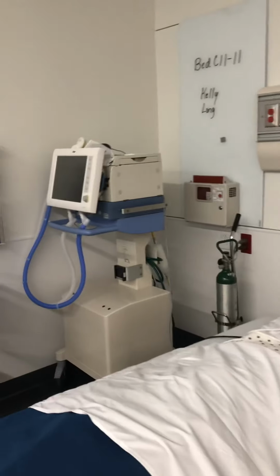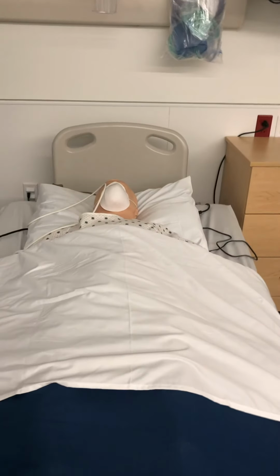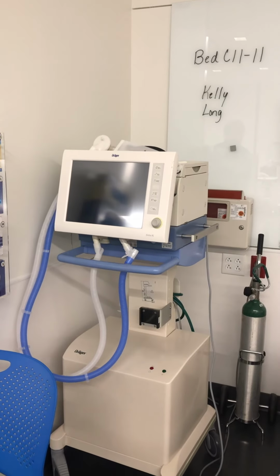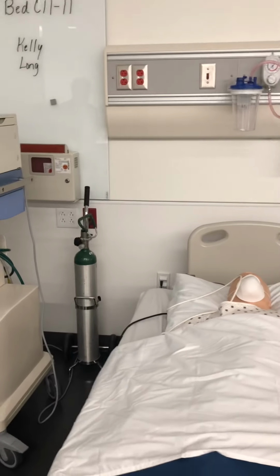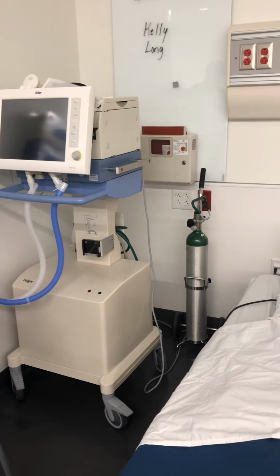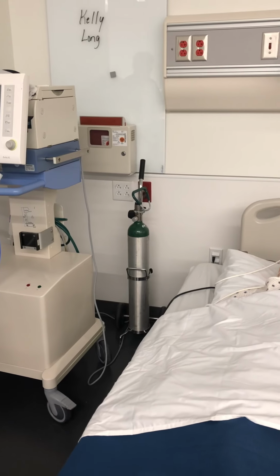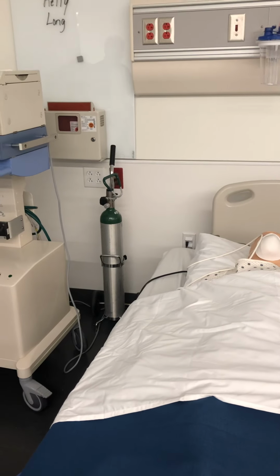We have here a mannequin also who we can have an EKG tracing, a heart rate tracing showing up on the monitor. We have a ventilator so that the students can learn how to control those and set those for if they were working in an intensive care unit. We also have oxygen, so the students can learn how to attach oxygen and administer oxygen to a patient.